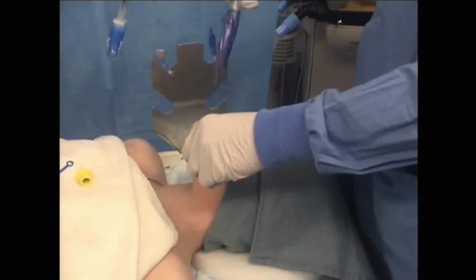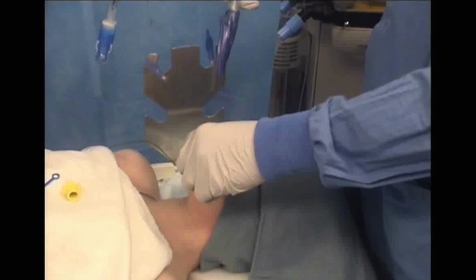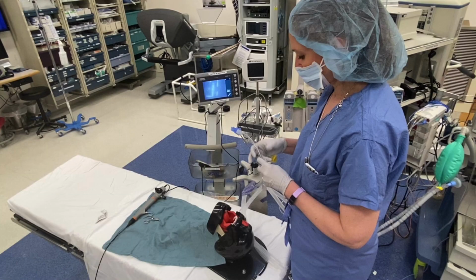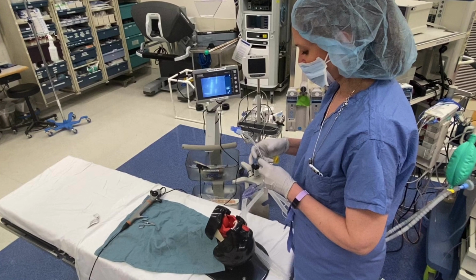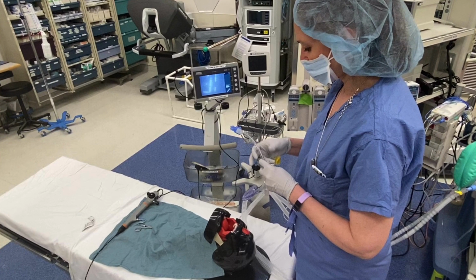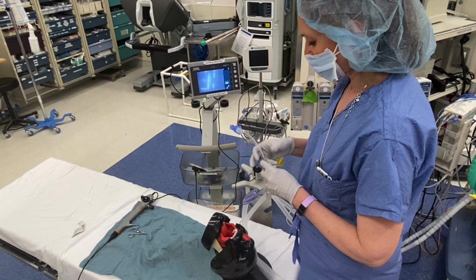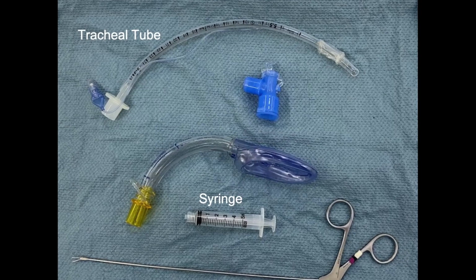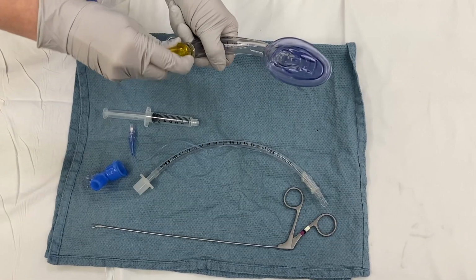Manufacturers state that their product will allow intubation, but most are not specifically designed with such described advantages. Always perform a simulated intubation sequence with your equipment before trying in a patient to verify the specific steps needed and how to address any difficulties. A tracheal tube and syringe are required. The syringe is for the cuff of the tracheal tube and, if needed, the supraglottic airway device.